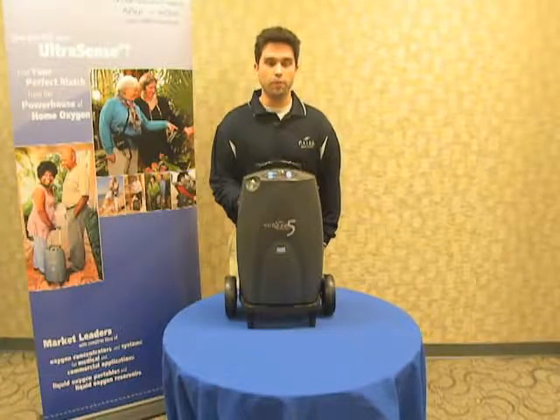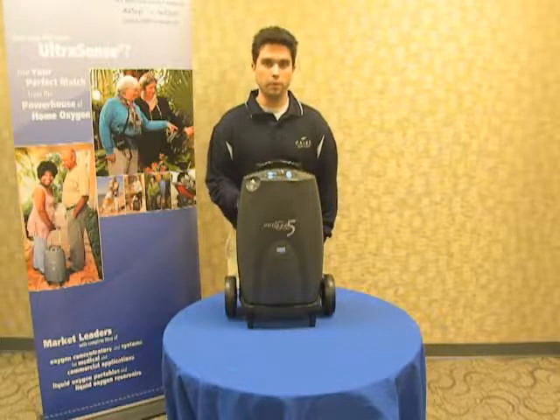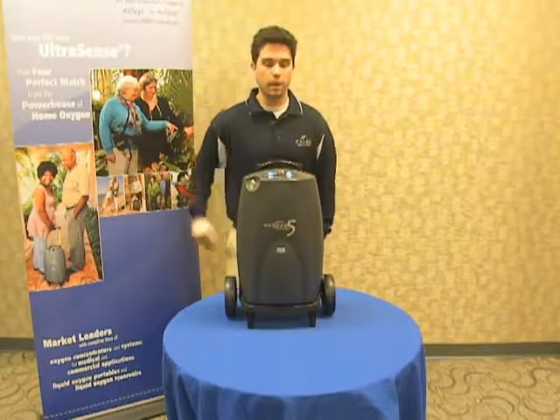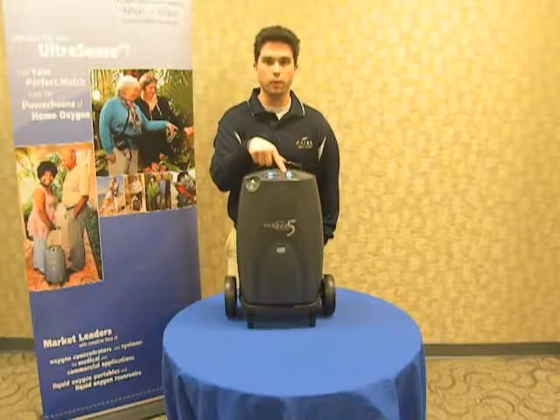The Eclipse 5 has full functionality when running on battery power. All flow rates up to 3 liters per minute and all pulse flow settings between 1 and 9 are available on battery power. To indicate that you're running on the battery, there will be an icon on the screen that's shaped like a battery on the far right corner.